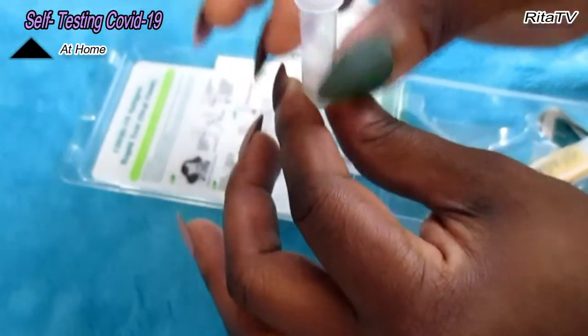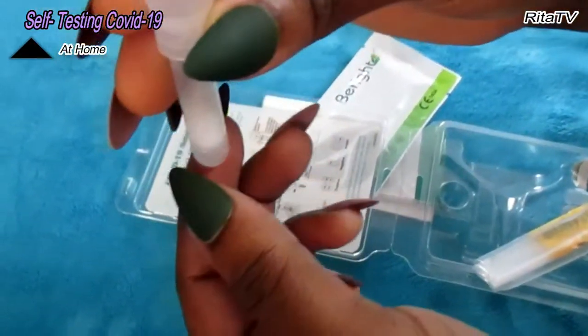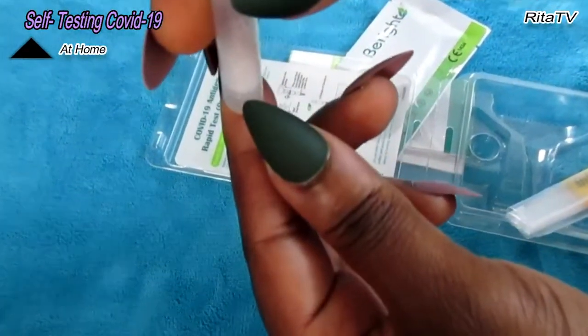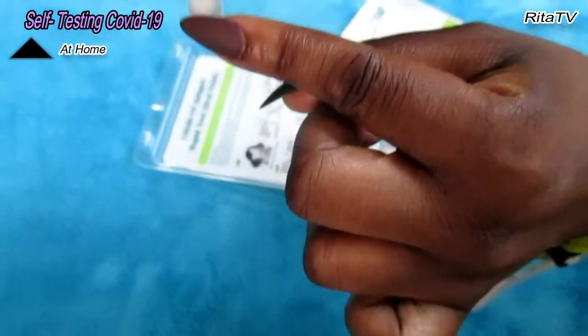The foam of the spit was a little bit higher to the side, but you have to make sure the main spit, not the foam, has to reach this point. There's 2 points, one line here, one other line here. The one here, that's where your spit needs to end. So the spit is at this end.